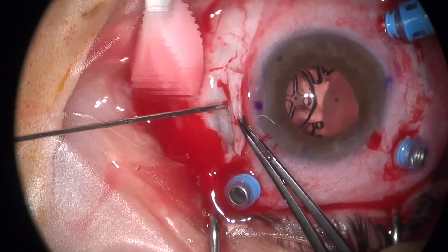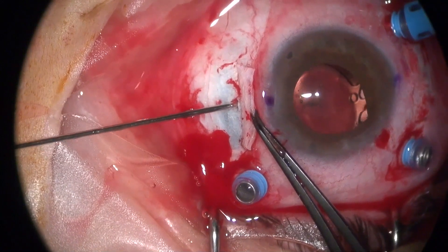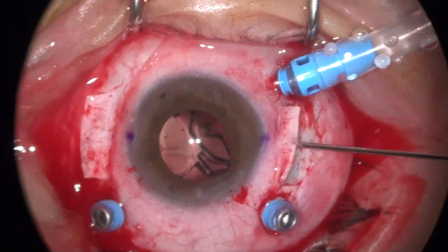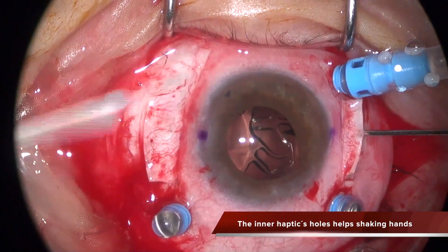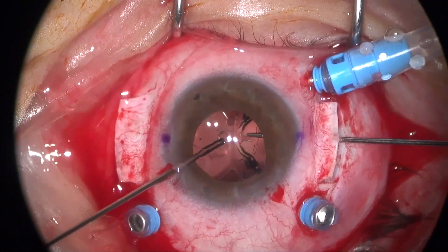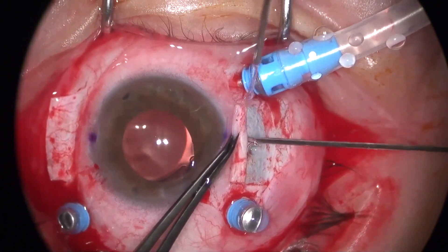Now I'm taking out the plugs of the lens. The lens is more rigid so you need to be a little bit more careful and do this movement slowly, because it takes more time for the T-plug to fold into the tunnel and then it gets out of the eye quite easily and gently. When you do the shaking hands maneuver, the inner extension of the plug makes things much easier because you can grab the hole and then make your second grasp in the center of the T much easier as well.